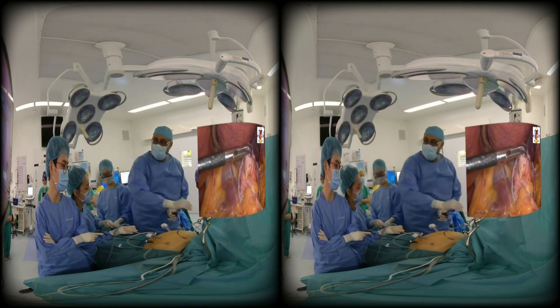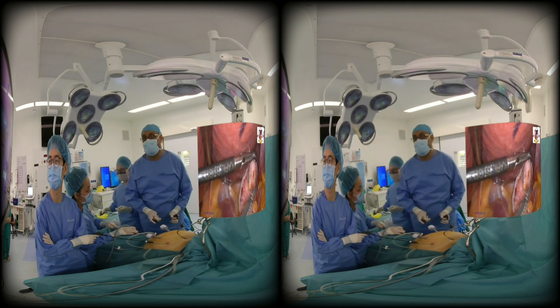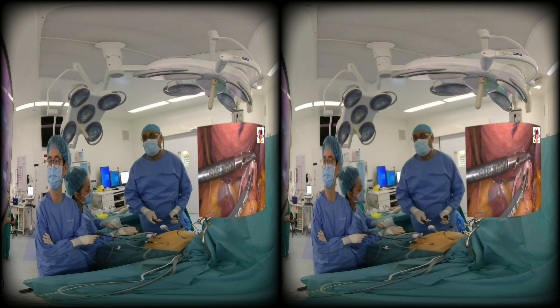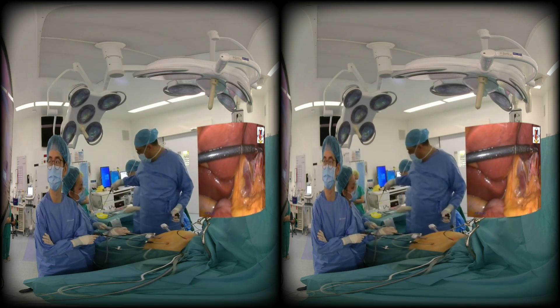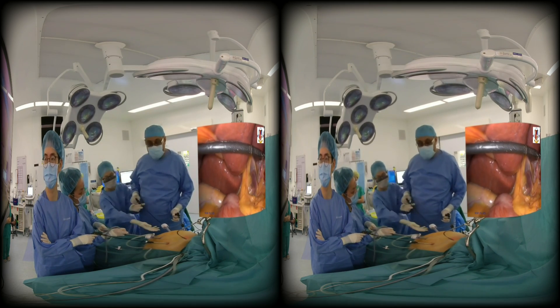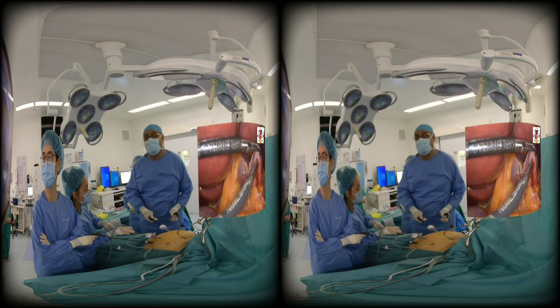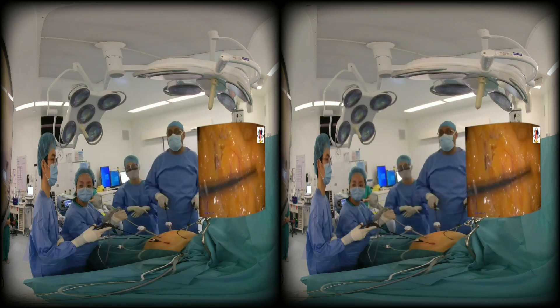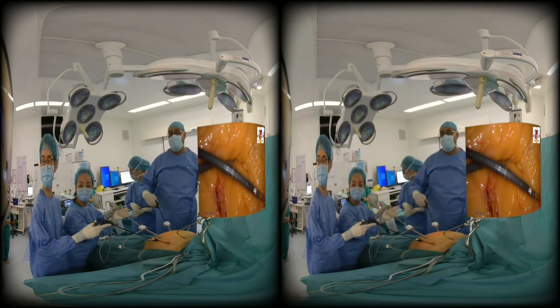Once dilated, sometimes there is a lot of fat along the posterior part of the stomach and you would need to dissect that out in order to get the pouch clear. It doesn't necessarily compromise blood supply because blood supply is coming from the medial side. Next, I lay the patient a bit flatter, flip the greater omentum towards the head end to expose the colon.